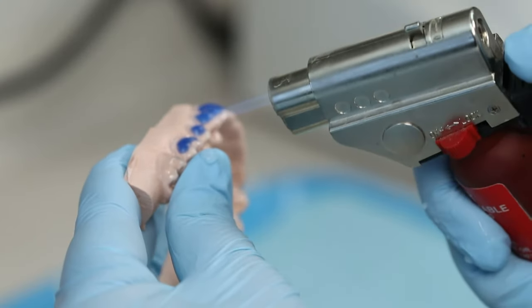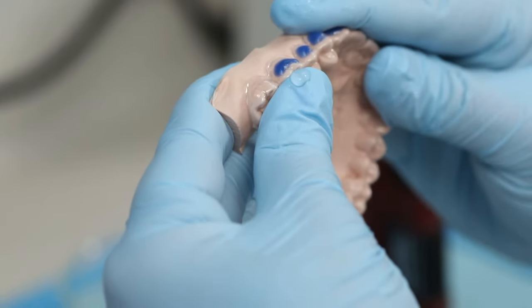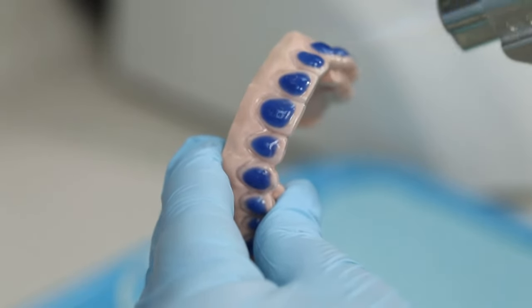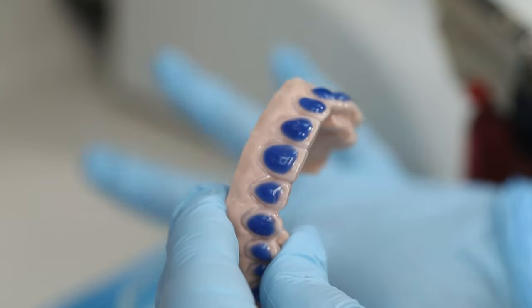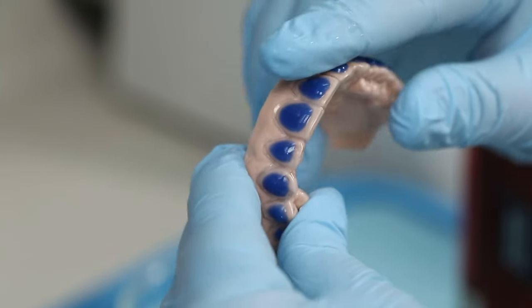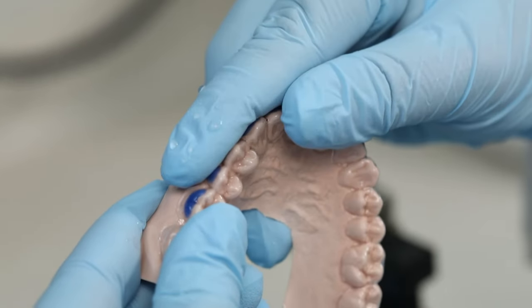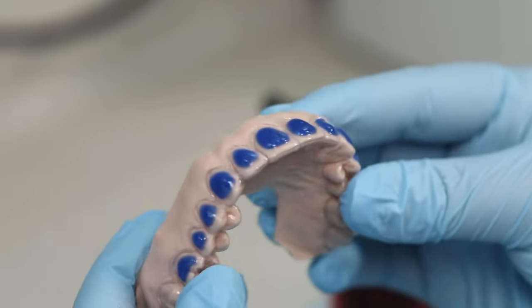Gently flame polish edges one quadrant at a time if necessary with a butane torch. While still warm, immediately hold periphery of each segment firmly against model for 3 seconds with water-moistened gloved finger. If this overthins the tray material, fabricate a new tray.